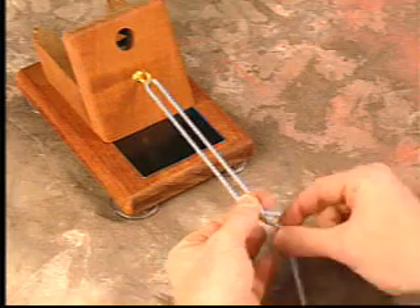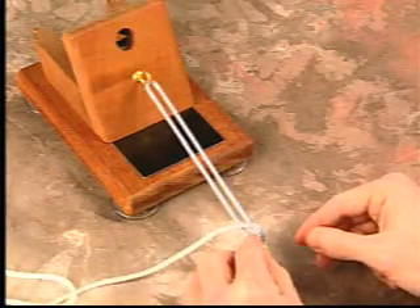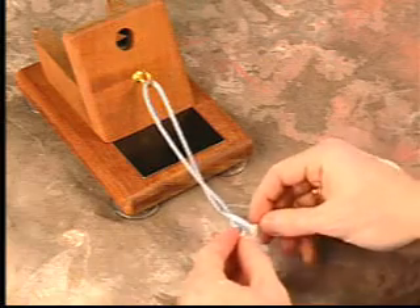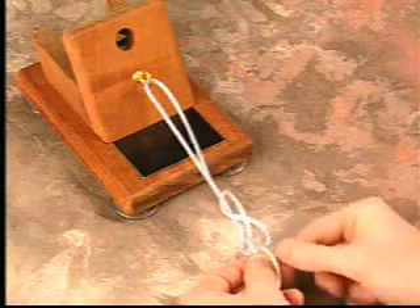An initial throw is done around both the post and the loop limb. The loop limb is then brought up in between the two sutures and subsequently placed back through the previous loop made by the loop limb.